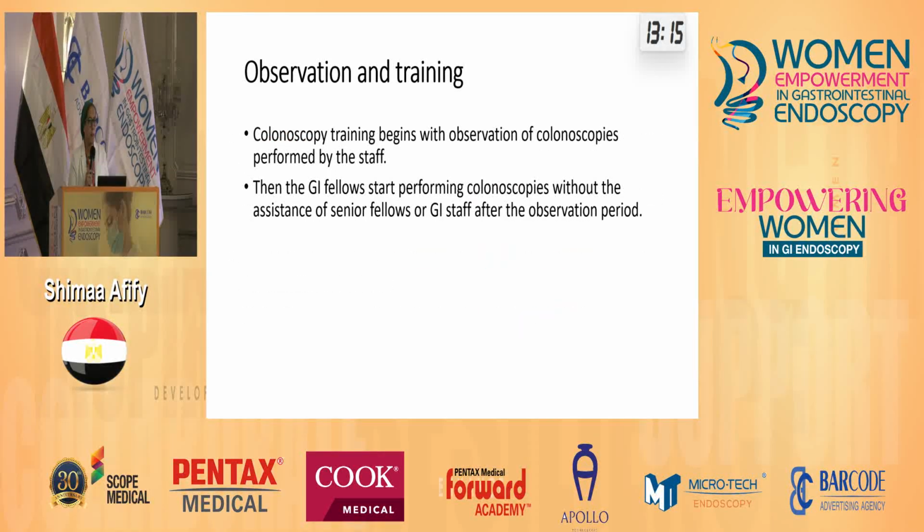The next step, after I have already cleaned the bowel and I'm sure that the patient is now ready for colonoscopy, is how to get into the training system for performing colonoscopy. So colonoscopy training begins with observations.